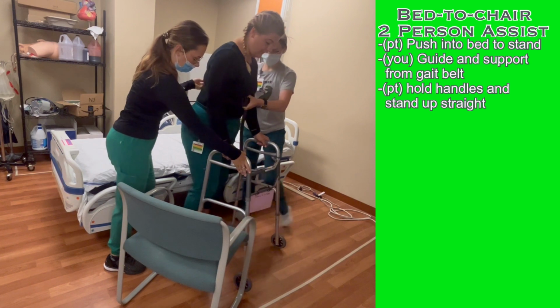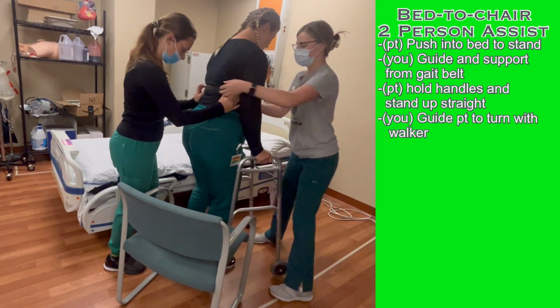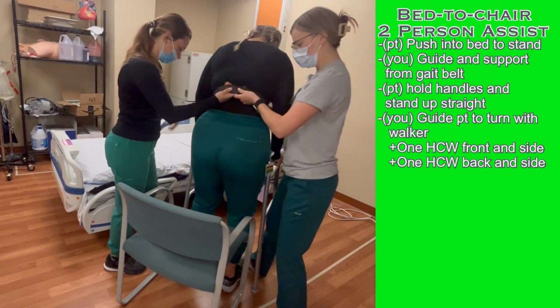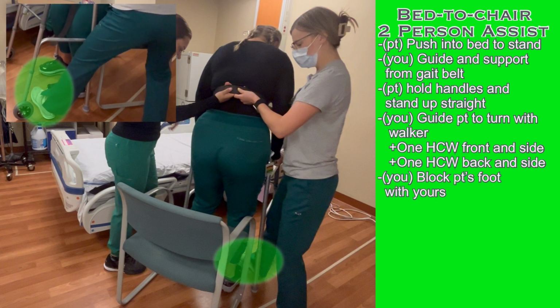With the patient in a standing position, use the gait belt to guide the patient as they turn with the walker. One healthcare worker should be to one side and in front of the patient, and the other should be to the other side and behind the patient, both supporting and guiding from the gait belt. When the patient is positioned in front of the chair, at least one healthcare worker should stand with their foot in front of one of the patient's feet to stop it from sliding.